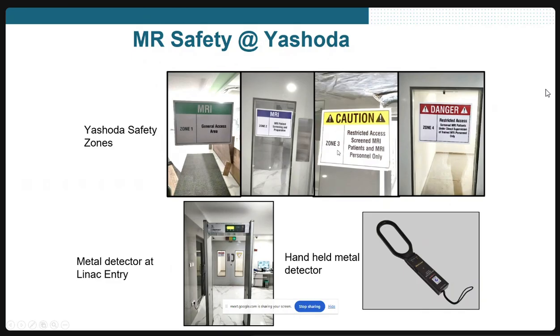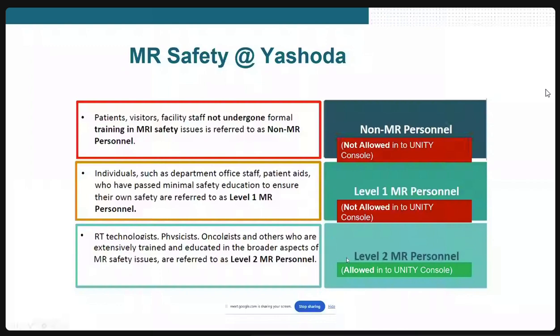So like in an airport, we have the scanner. We check every patient when they go in, and every visitor who comes here, and then we make sure that everything is going fine without any problem, because there is a possibility that somebody who is not supposed to go in went inside. We know that MRI accidents have happened. People got stuck between the oxygen cylinder and the MRI machine, and it's very painful and very difficult to remove the patient from that.